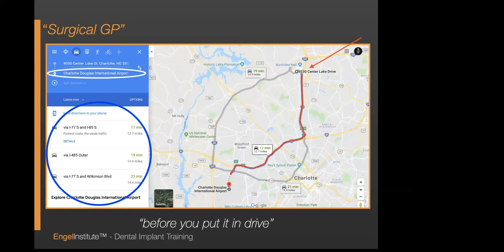So in order for you to get to destination B, you have to tell them where you are. And this is the same not only with guided surgery, but this is the same with surgery or dentistry in general. When we know the end result, then all we have to do is navigate with our intelligence, with our equipment, with our surgical intellect, our technology, and we can get there. But you have to be able to see the end result.